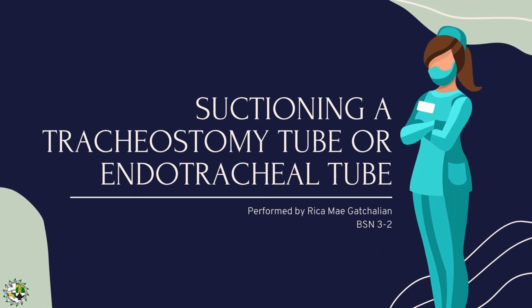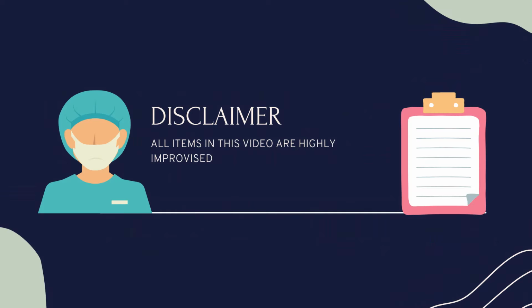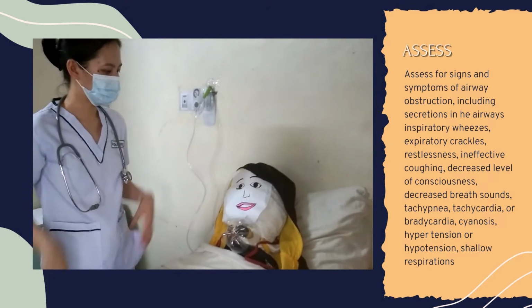Good day, I am Ricame Gatchalian from 3rd year, Block 2, and today I'll be performing suctioning a tracheostomy tube or endotracheal tube. But first of all, I want you to know that all items in this video are highly improvised.